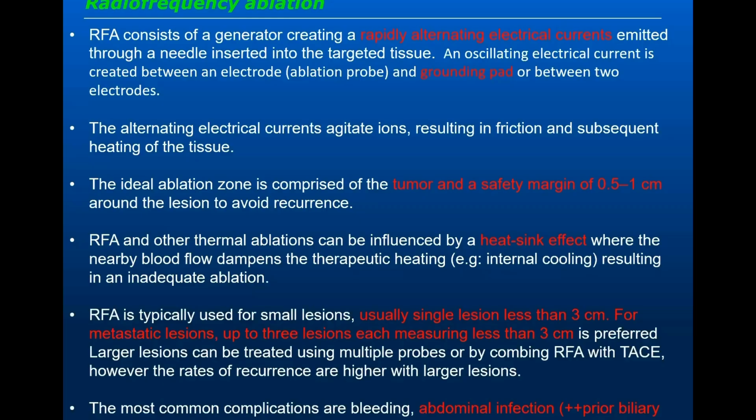And it depends on two things: the rate of heat deposition and the rate of cooling. This means that radiofrequency ablation is considered on the low side of heating, so it takes time for the heat to build up. Now, if you have a big blood vessel and this blood vessel has lots of flow, it will definitely cause the cooling. And that's why most of the time, if we get recurrence in these tumors, it's almost always close to a blood vessel because of this cooling effect.